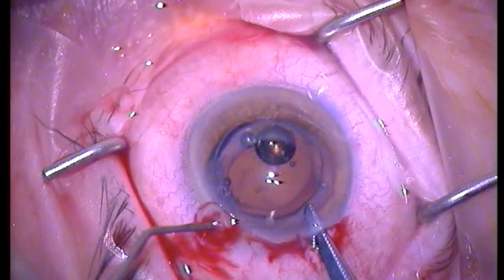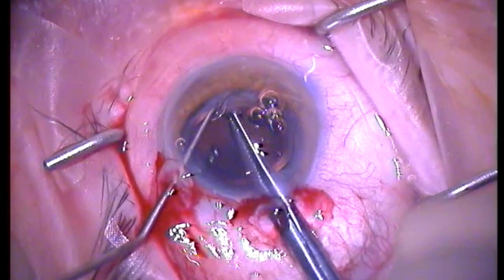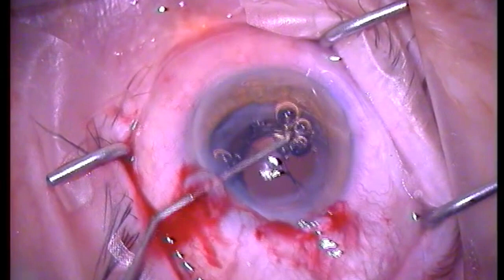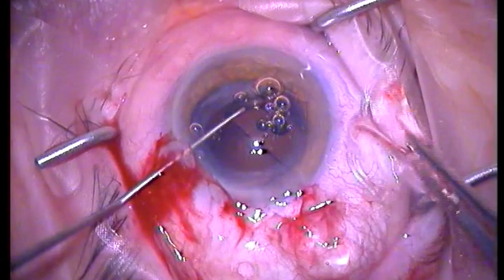Once the lens is safely in the AC and away from the corneal endothelium, I'll use a Sinskey hook with scissors to bimanually introduce the lens to the scissors and then carefully cut it, always being careful of the possible flexion bend of the lens while cutting. Again using the Sinskey hook to keep the lens away from the endothelium, and using McPherson's forceps to pull the lens out of the AC in those two segments.